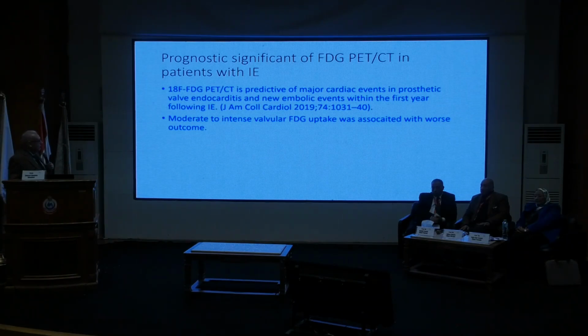Prognostic significance of FDG PET-CT. This is a study published in 2019 saying that positive FDG PET-CT is predictive of major cardiac events in prosthetic valve endocarditis and new emboli events within the first year. And they say that more intense uptake is associated with worse outcome.